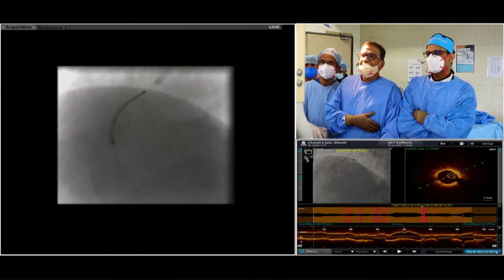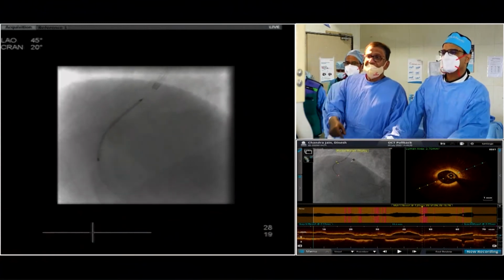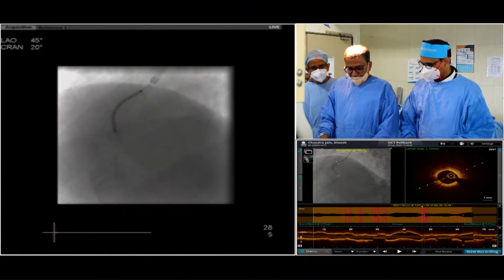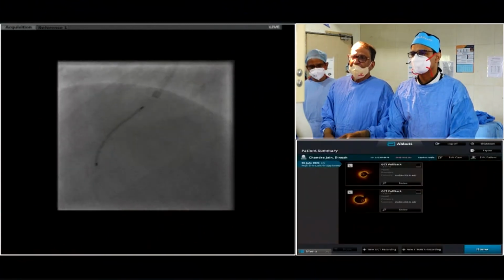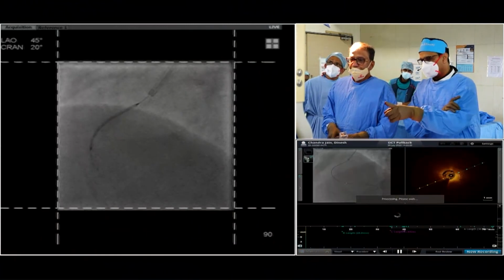Overlap is more. No, it's fine. Can you give that co-registration marker proximal? Ajay, have you already inflated it? No. Let's do another stent boost, and I want the co-registration marker.